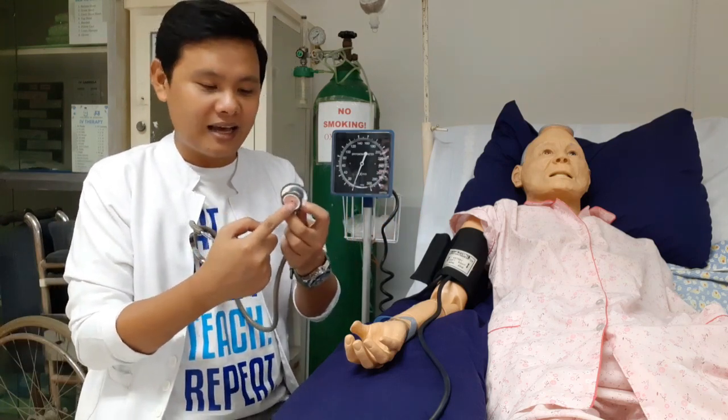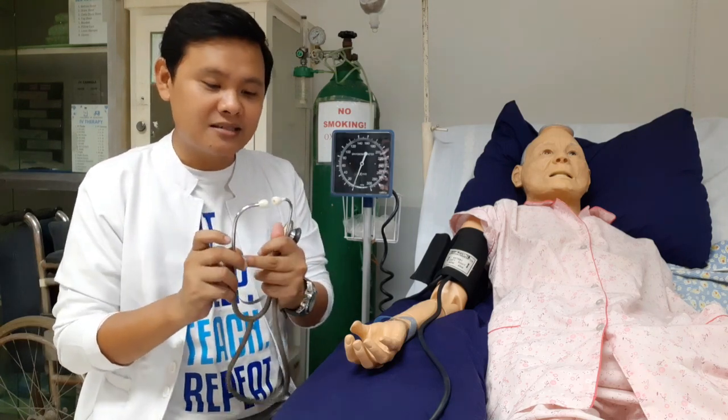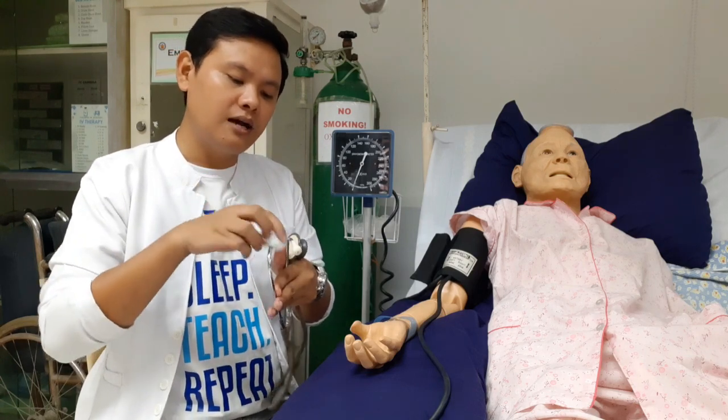The bell. Okay? The bell is what we will use. So first, you have to cleanse the earpiece. Okay? Using the alcoholized cotton balls. Alcoholize this, alcoholize it.